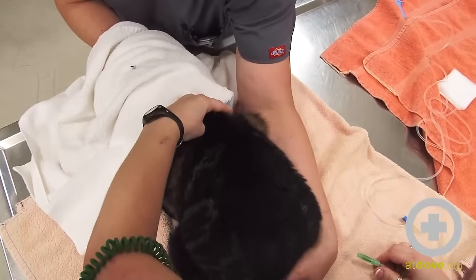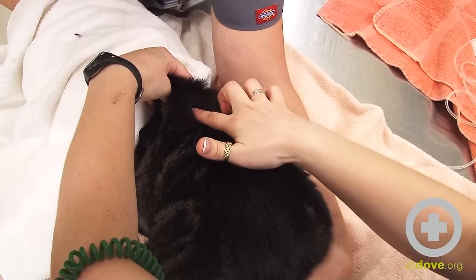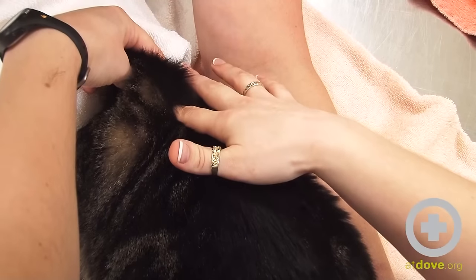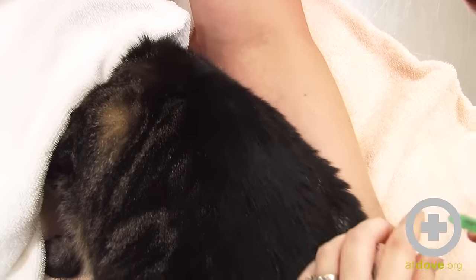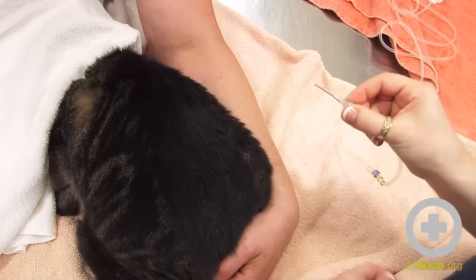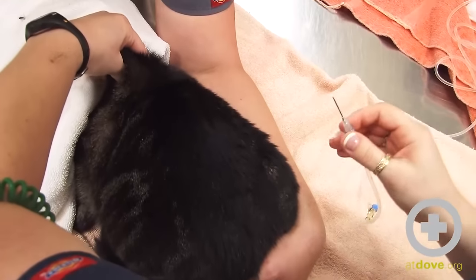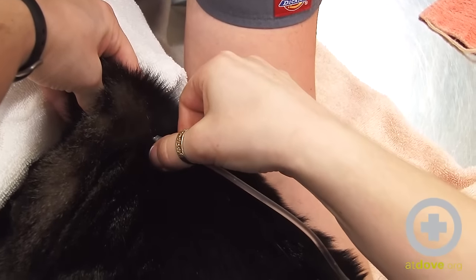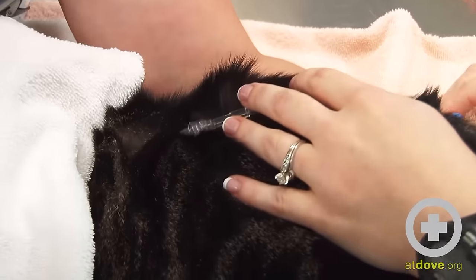I'm going to lift up the skin and it's going to make a nice tent here. If you imagine my finger was the needle, I'm going to go into that tent right in between my fingers so that I'm not poking myself and I'm going straight through the skin. Now I'll take the cap off my needle and aim it bevel up — the little angle on the needle faces up. When I lift up his skin I'll find that tent shape with my finger and poke in there with the needle. You should feel just a little bit of tension when you go through the skin, and then it should feel easy after that — that's how you know you're in place.